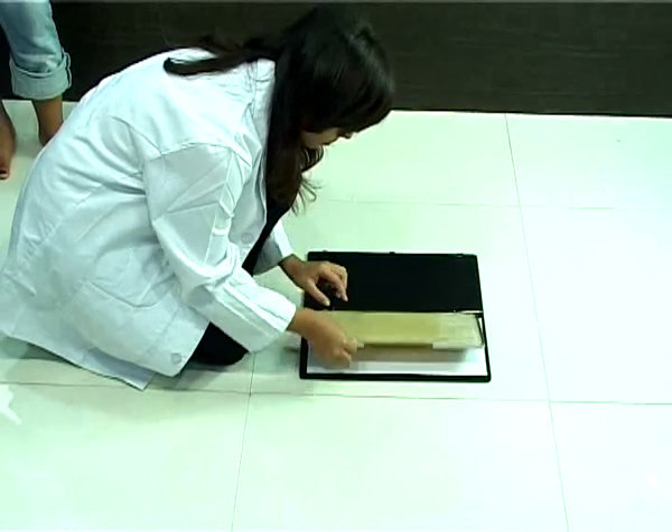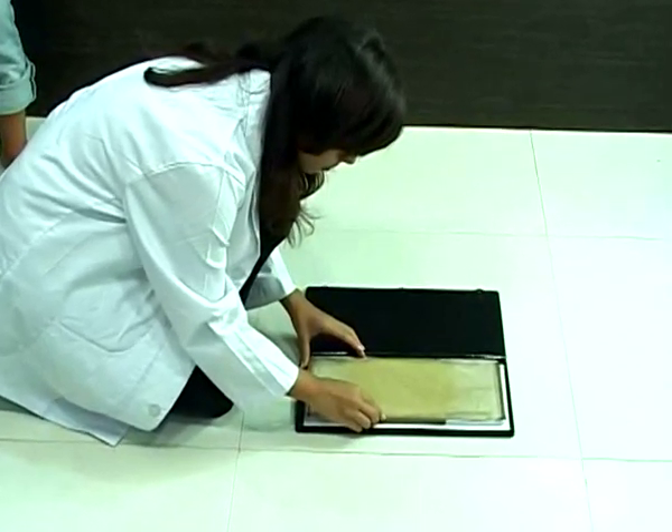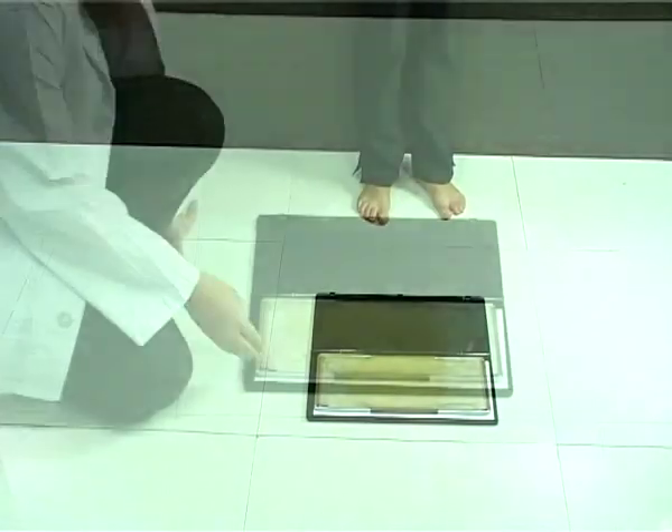Place the white side of the prescription pad in the foot imprenter. Close the mat so that the grid portion of the mat is facing the paper.